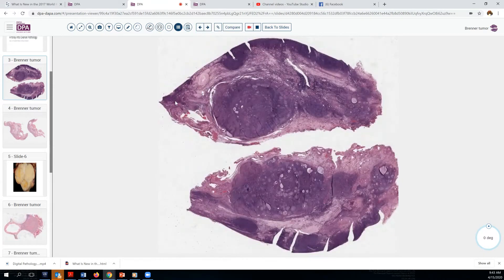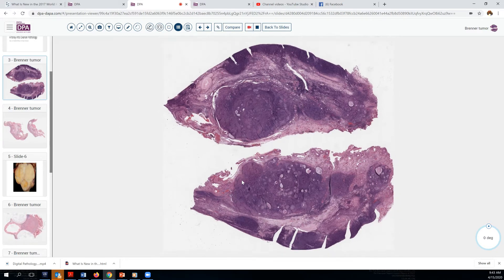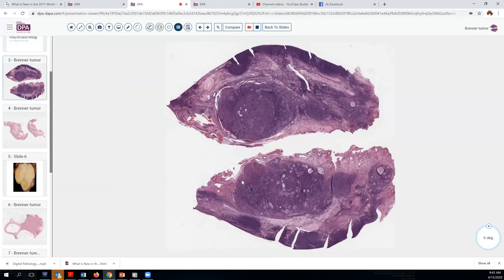Here's a representative section, and you can see we have some normal structures here at low power — the corpus albicans and cortex of the stroma — and then we have this more bluish area here on section that looks a little bit different, a little bit odd, and worth looking into.